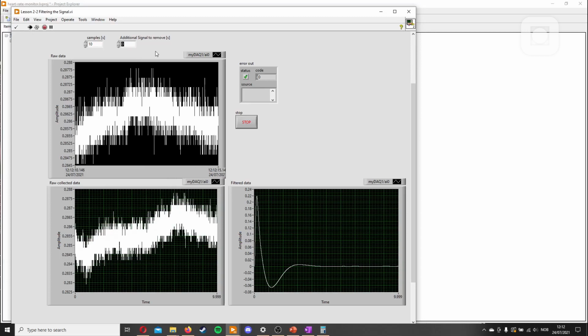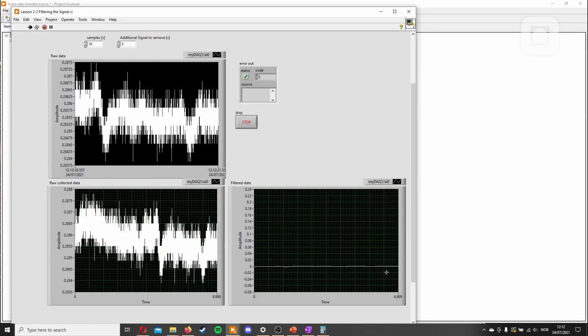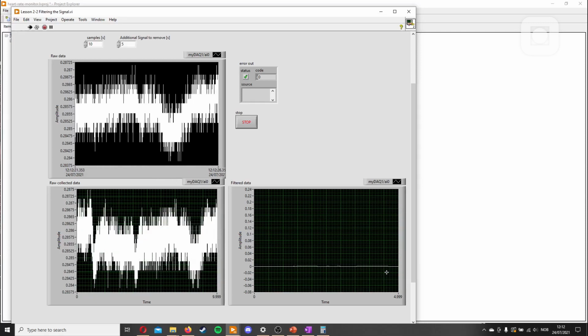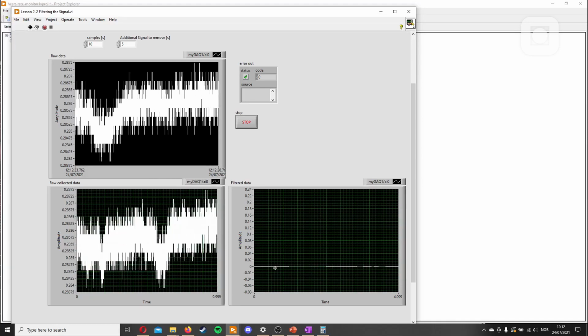It's probably less, but let's just write 5. It would remove the part of the signal which is for the filter to stabilize. And we just got this flat, clean signal now.